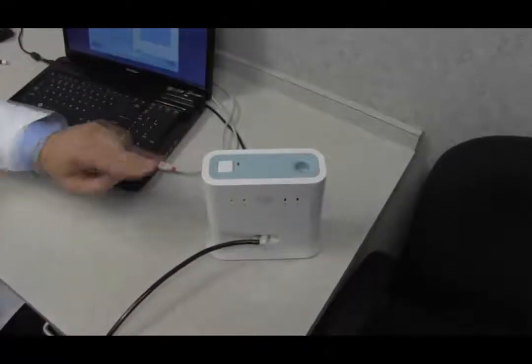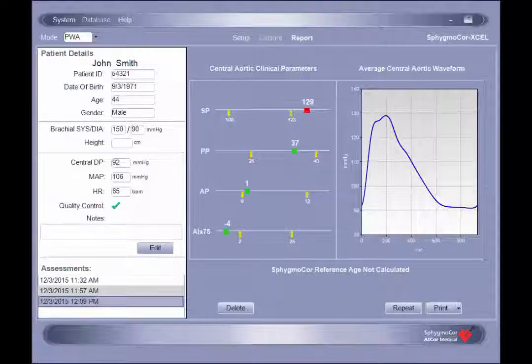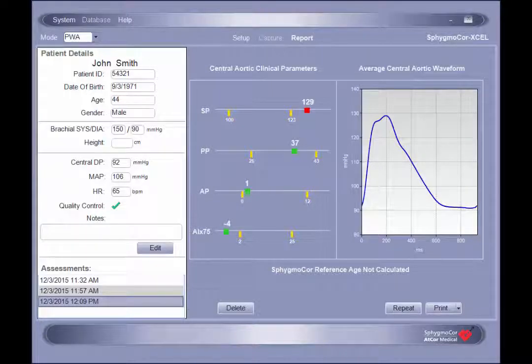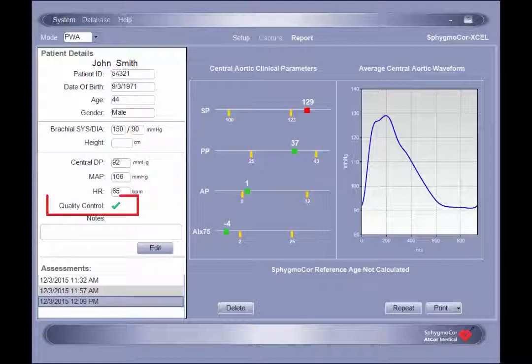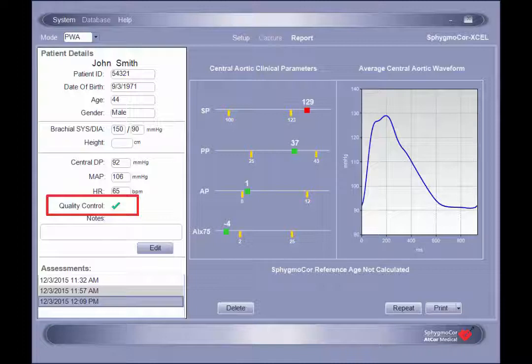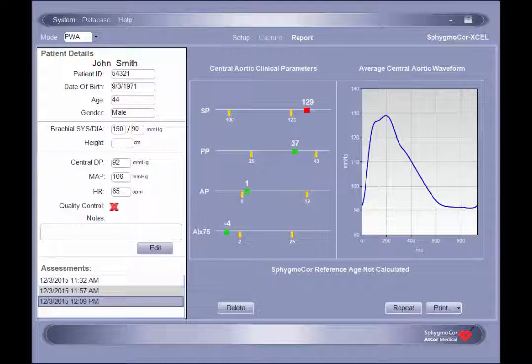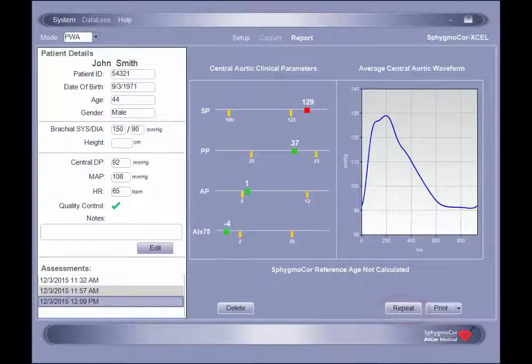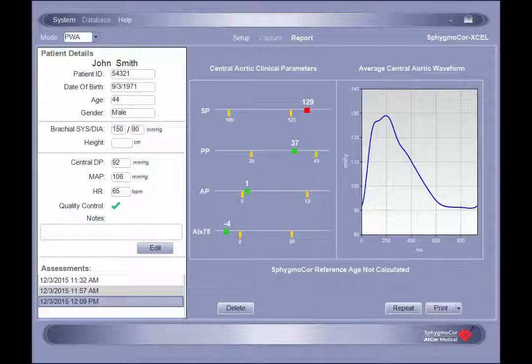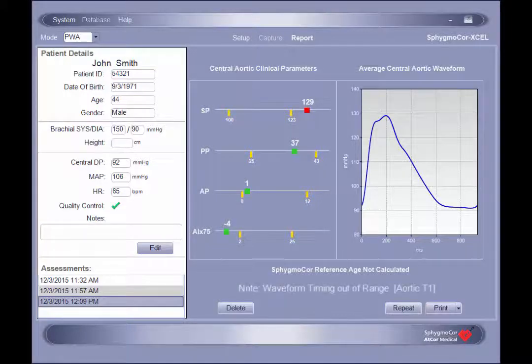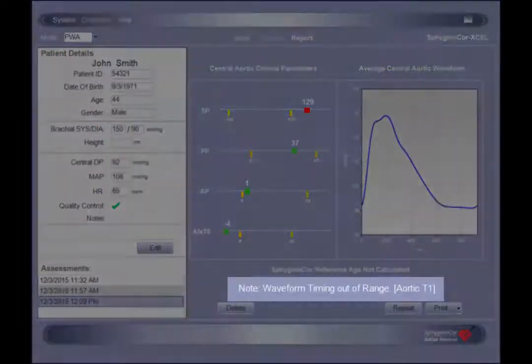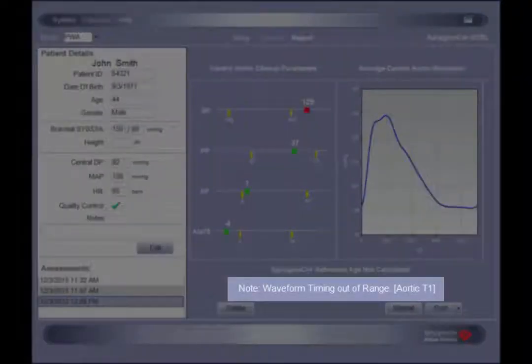At the conclusion of the assessment, the report will be displayed. It is important to always first evaluate the quality control indicator to determine if the report can be considered acceptable. A green check is an indication of an acceptable assessment while a red cross indicates that the assessment should be repeated. To repeat an assessment, simply click the repeat button in the lower right-hand corner of the report screen. Additionally, some reports may be labeled with a note in the notification area. If a report is labeled with a note, it is recommended that the assessment be repeated.